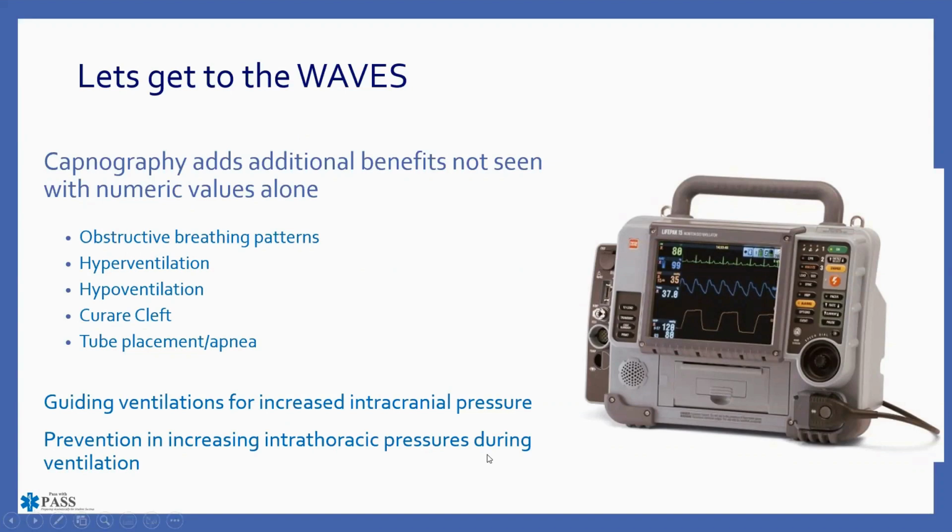This probably gets better with experience, but certainly you can remember back to when you were brand new, an EMT, maybe a brand new paramedic, and you did not have a lot of experience with ventilating patients. You can hopefully go back and appreciate that maybe you didn't do it necessarily by the book. You were breath stacking, you were giving way too much tidal volume just because you're nervous and trying to do a really good job, but it actually ends up causing some demise to the patient. So if we have capnography, we can prevent some of these things from happening.